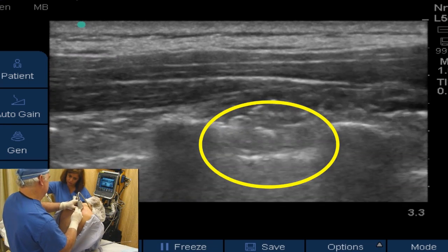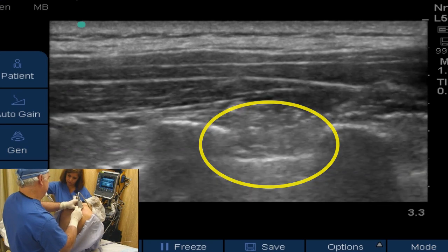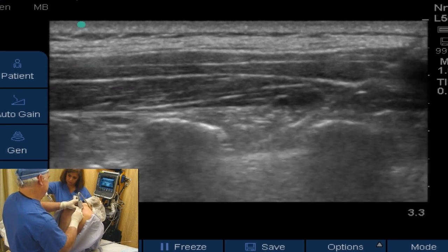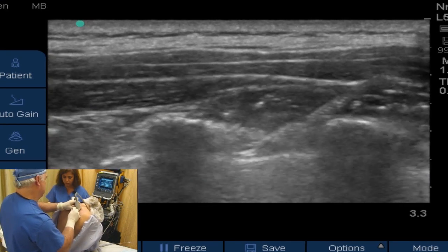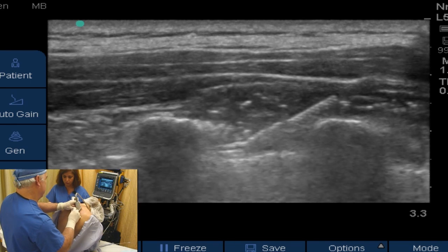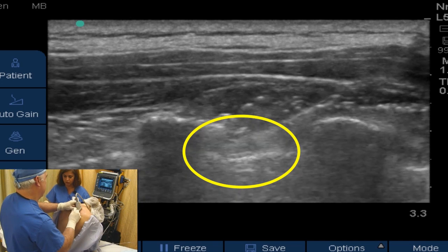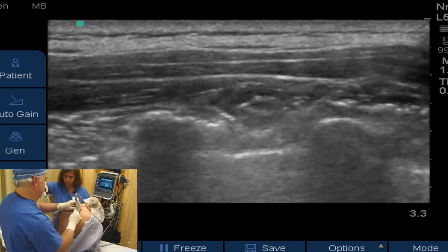Obviously, we've got to be careful and you want to know where the pleura is and the tip of your needle at all times so that you don't advance the needle through the pleura into the lungs. You see the needle in this view very well. Now we bring our pleura back into view so we can see the tip of our needle right here above the pleura, but below the costal transverse ligament, so we can deposit our local anesthetic in the space that we want it to be in.